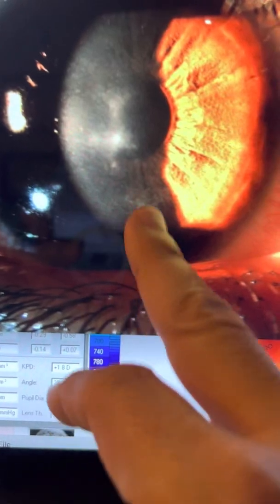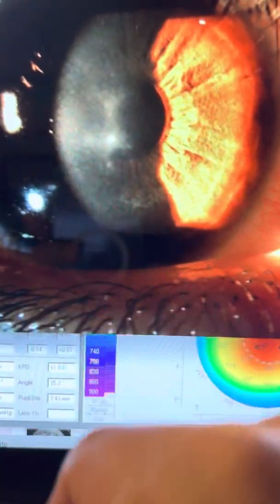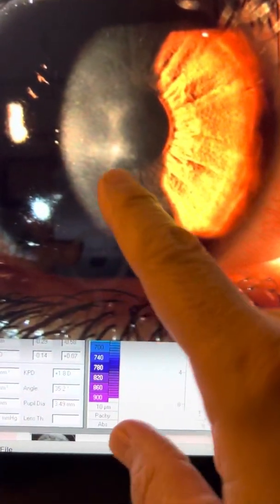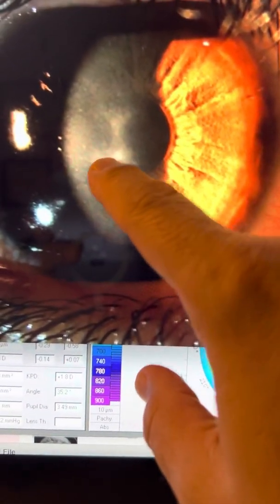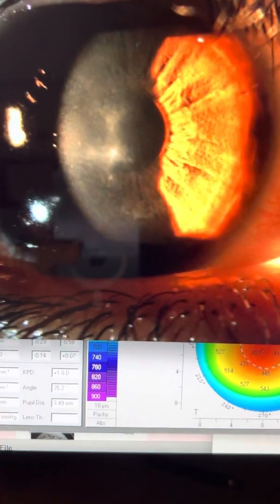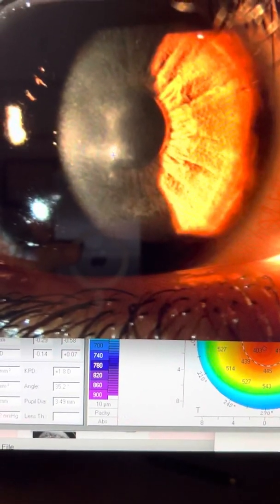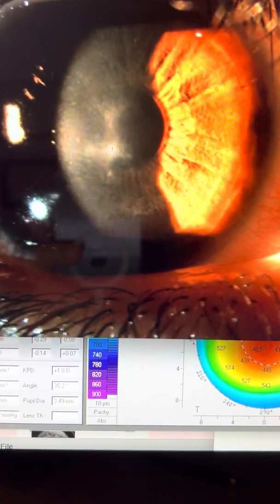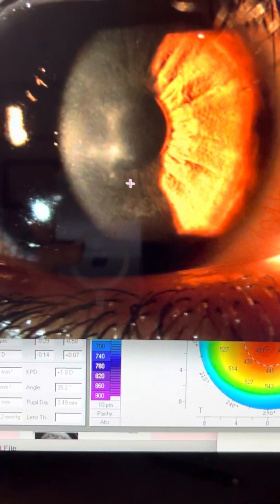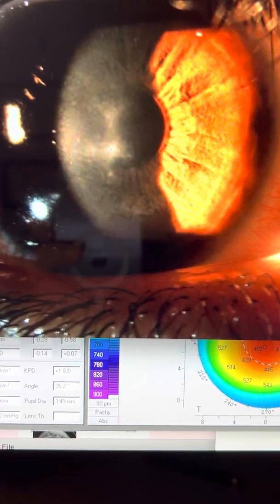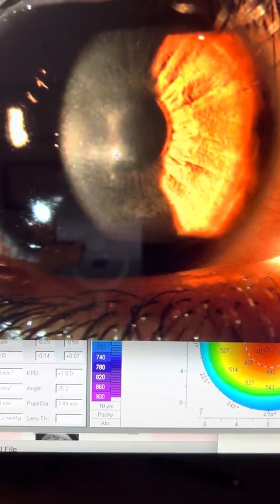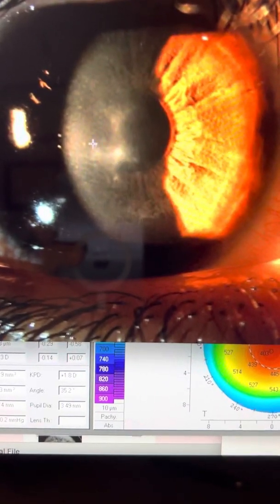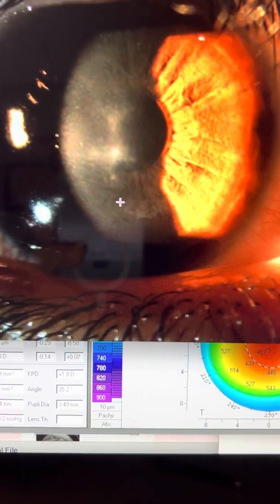I'm secure that this will have improved dramatically. If not, I'm going to rub this necrotic epithelium, almost a Salzmann-like hyaline deposit in the epithelial space with a Q-tip and let it heal.